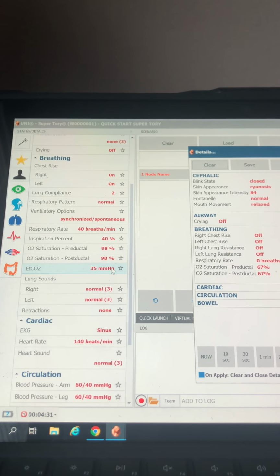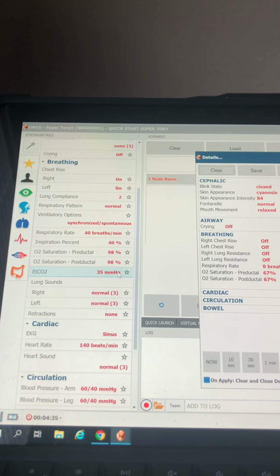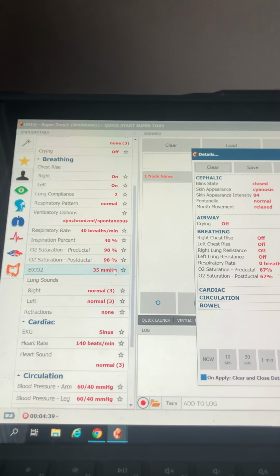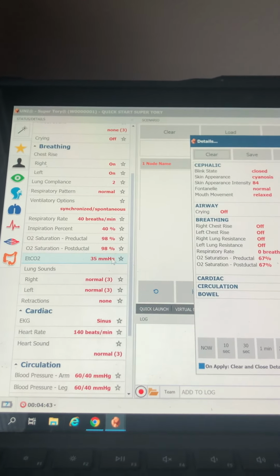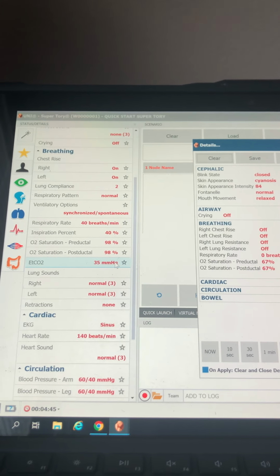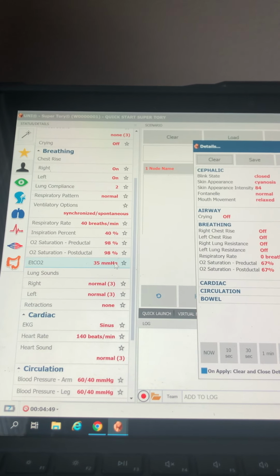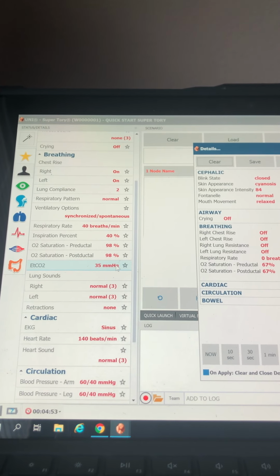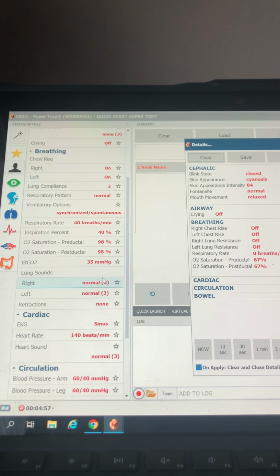We actually run into the simulation room, we cover our faces, and then click on the button on the monitor to make sure that it turns on, because we haven't figured out a way to do it otherwise without having that flat line, because we don't want the learners to get a hint that they have their CO2 monitoring. Usually we do another type of cue, whether we have our neonatologist come in and ask for that reading, or an RT or a facility RT will put it out there.